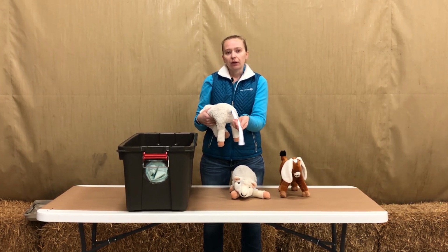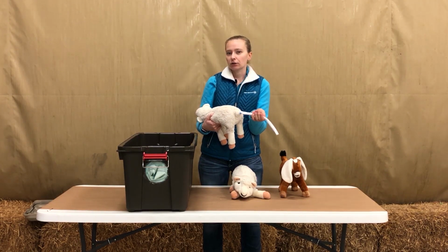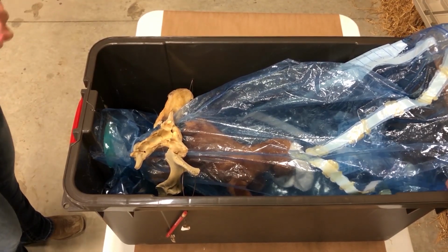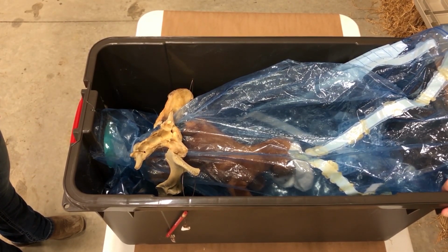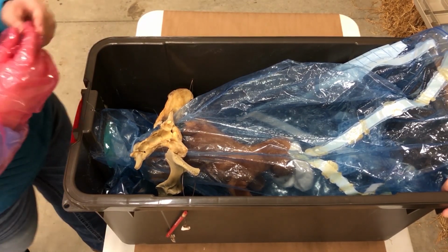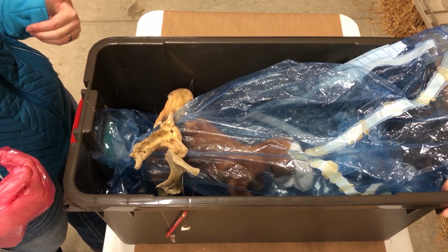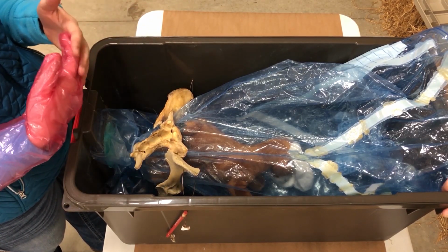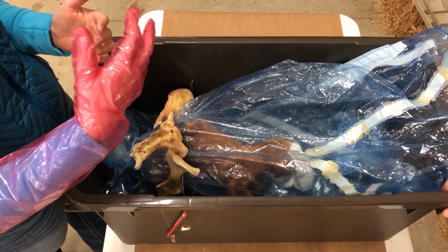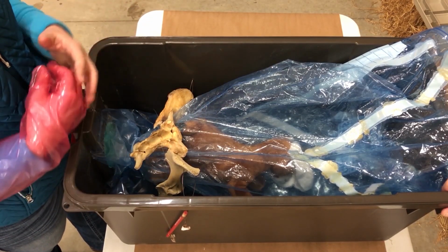Obviously the tail is going to feel like it has little vertebrae. In this animal there's a little fake pearl necklace, so that's how that would feel. So when we talk about a breech birth, we have an option or we have a decision to make. Do we want to try and push the lamb back in and spin it around, or would we rather pull that lamb or kid backwards? In most instances, if you have a really old ewe, you might have some space to turn it around. A lot of times it's going to be easier to pull that lamb out backwards, or kid.